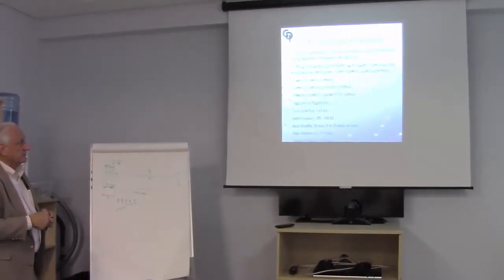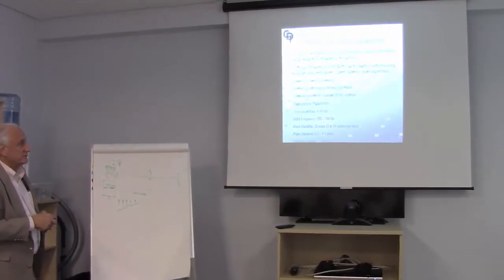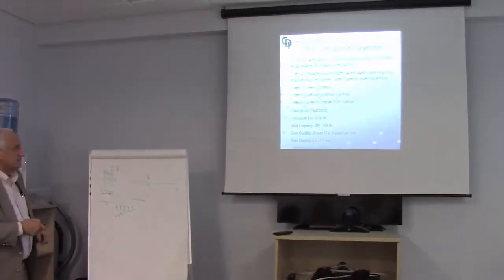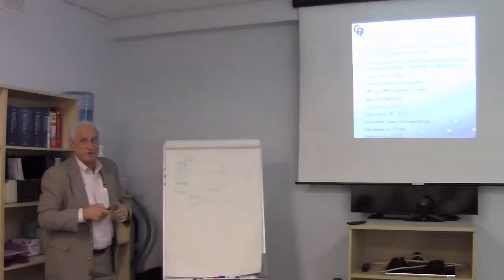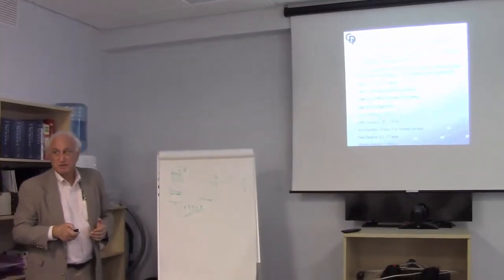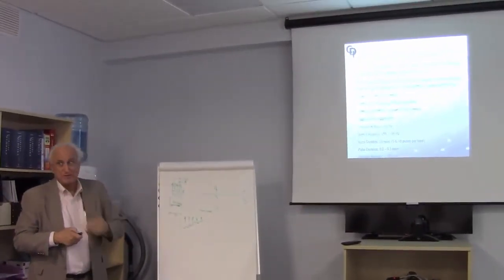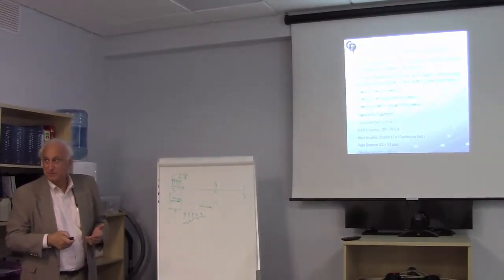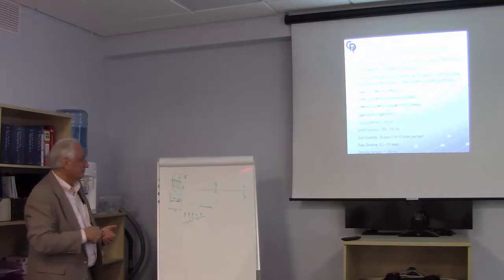Okay, the burst frequency, we usually use 250 hertz for this burst. 500 hertz is probably the highest that people use, but occasionally we'll talk to someone who uses 600 or 700 hertz. I'm not sure they're getting benefit when they go that high for the burst.